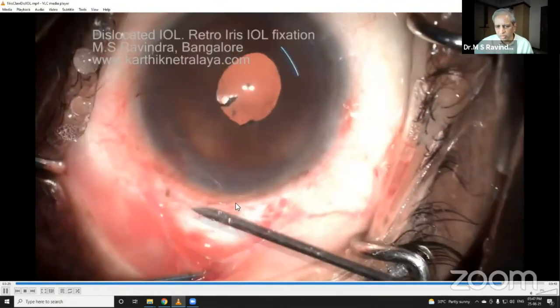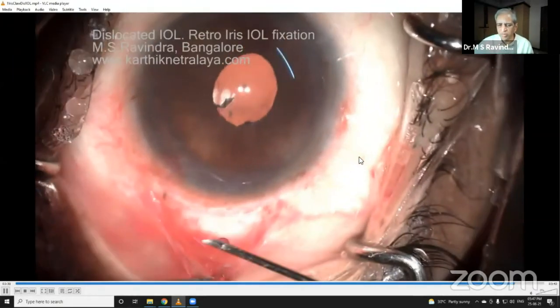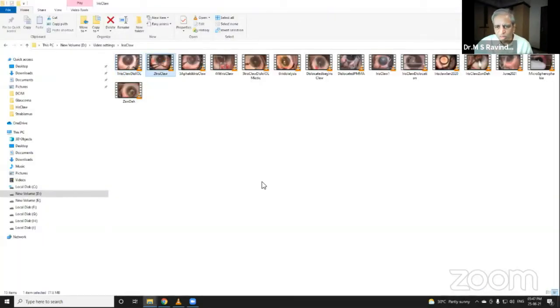Glue this conjunctiva and Tenon's back from the sclera, and you don't have to bandage the eye. The patient will start enjoying vision right from that time and you can start the post-operative medications. I'll just show one more video.